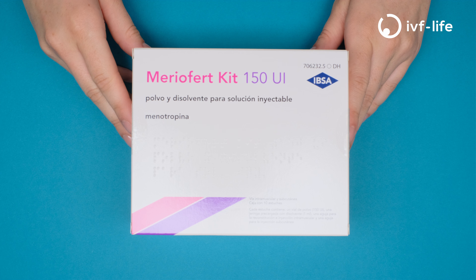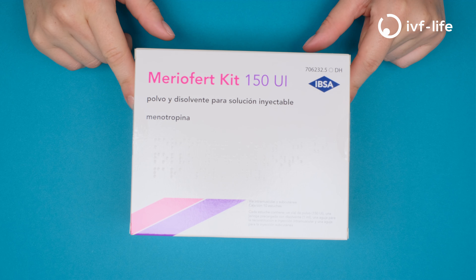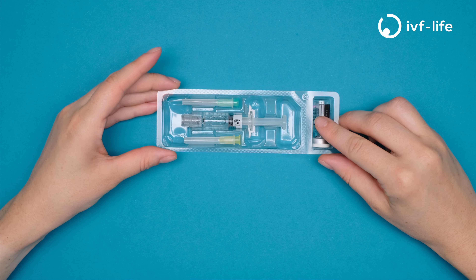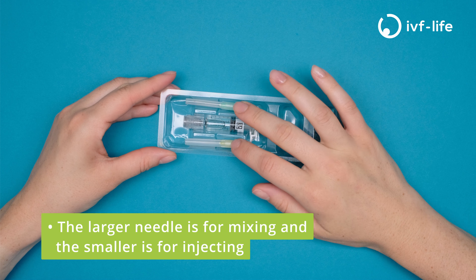These are the instructions on how to prepare Meriofert. In this case we will be preparing 150 units. In your box you will find a vial of powder, a pre-filled syringe full of water, and two needles.